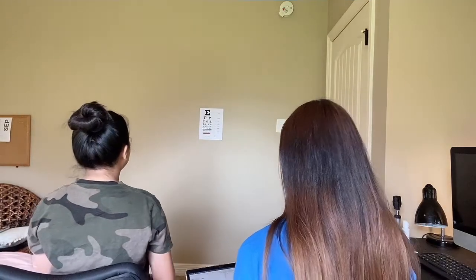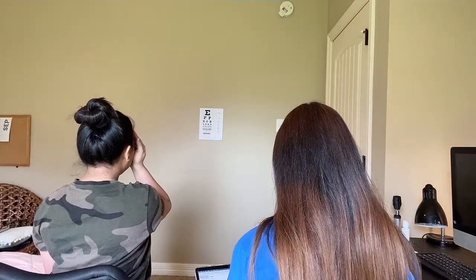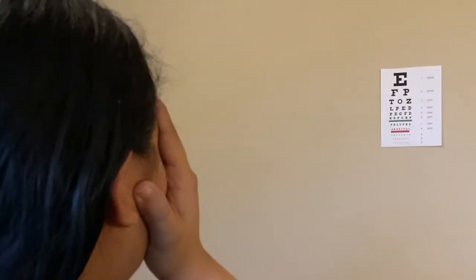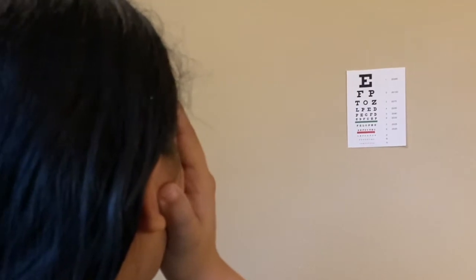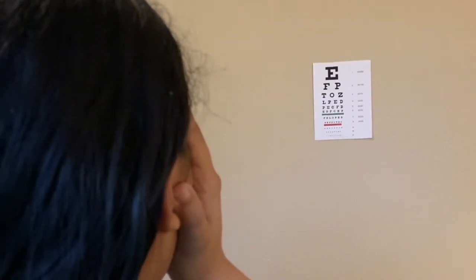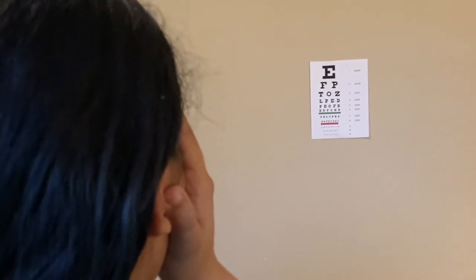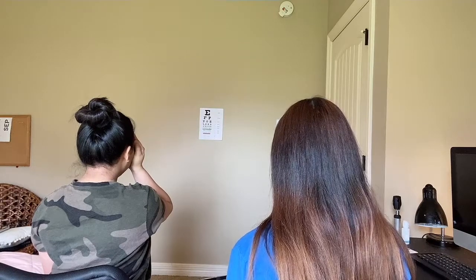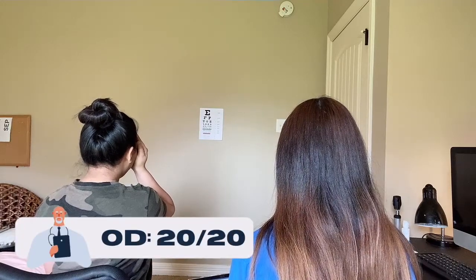The first part of the exam is the distance visual acuity exam. In this exam, we ask the patient to sit or stand 20 feet away from the chart. We ask the patient to cover one eye and let them read the letters from left to right, then from top to bottom. Until such time that the patient correctly identifies only half the optotypes on a line, we note the corresponding acuity measurement shown at the line of the chart.